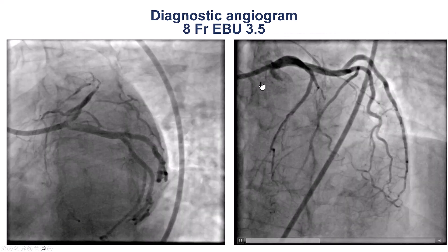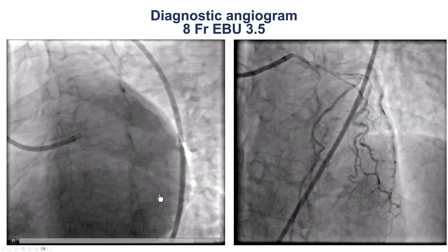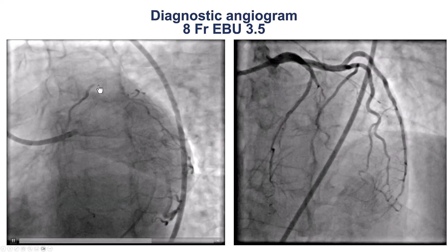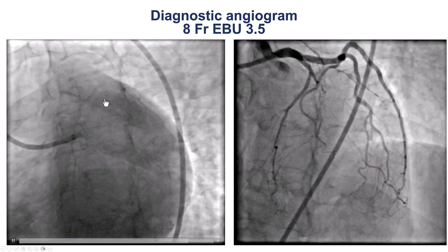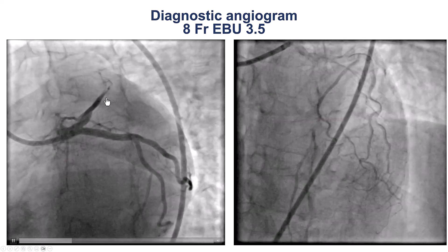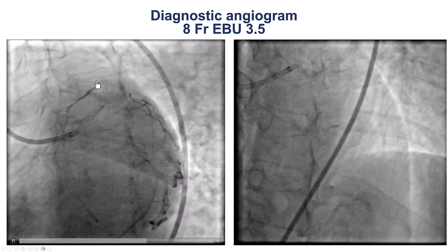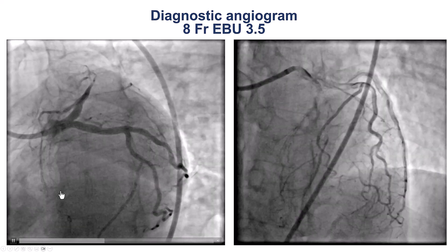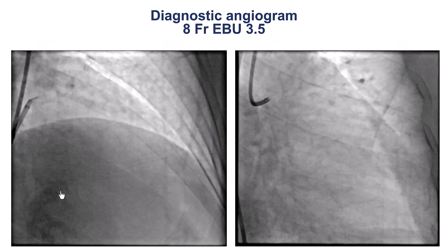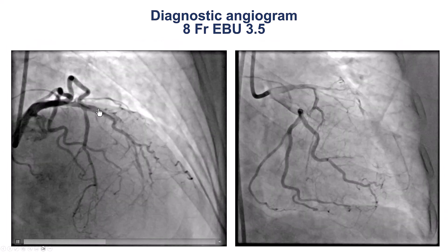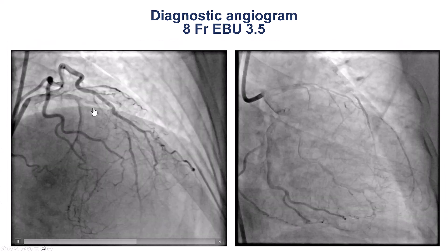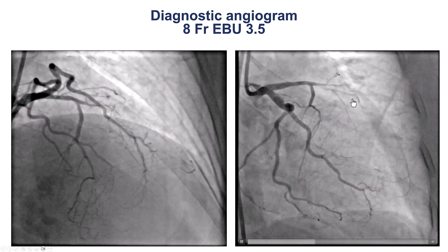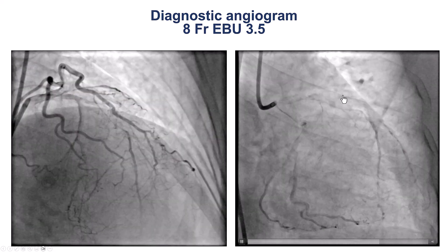On the left side, there was no significant disease in the circumflex. The proximal LAD was tapering down to the middle LAD, with some diffuse disease in the middle LAD and the distal vessel filling via ipsilateral collaterals. The cranial projection again shows the occlusion with a tapered entry, and there is some ambiguity towards the proximal cap.